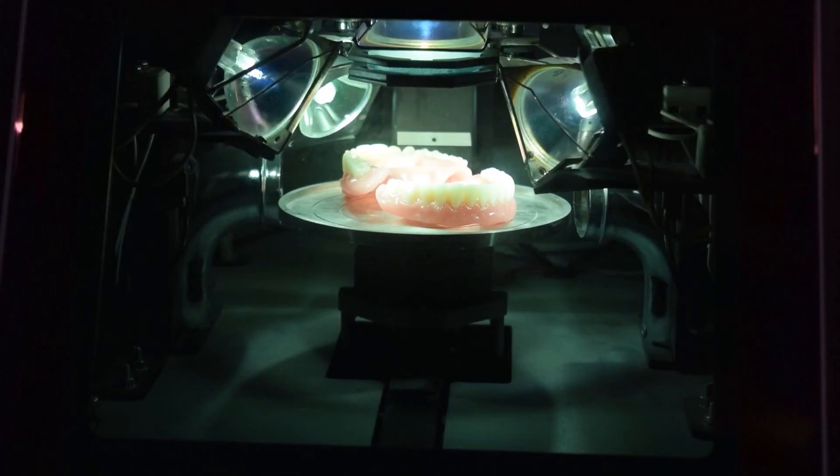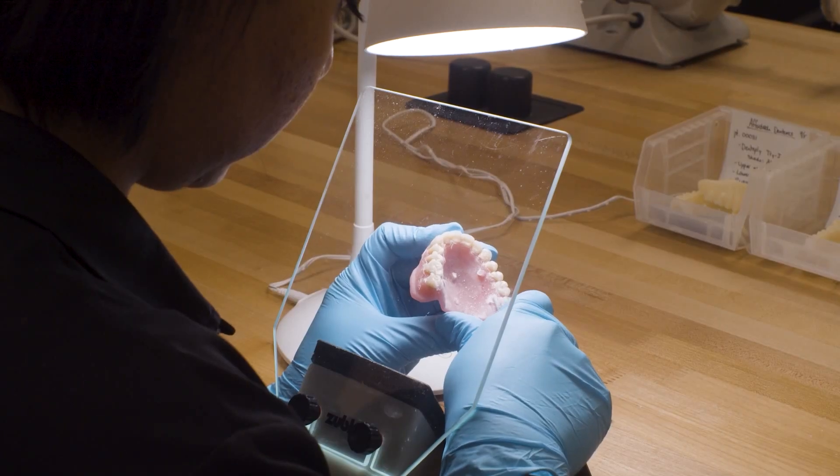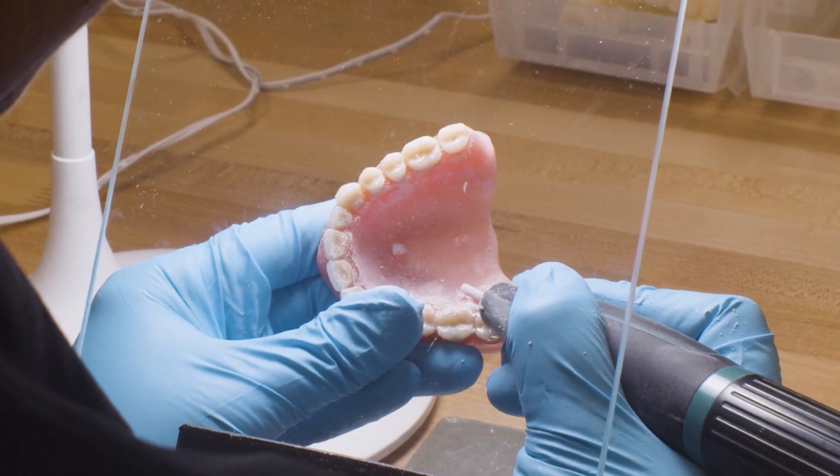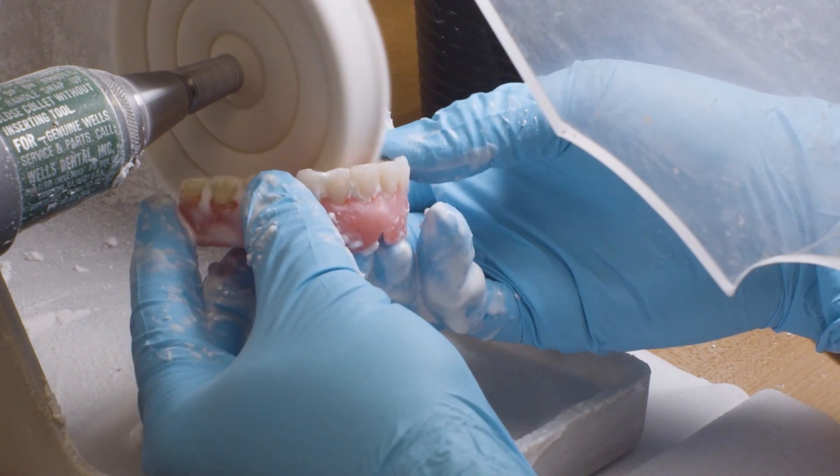Once the teeth are placed, the denture is placed in a UV oven for final curing. The UV light activates the photosensitive resin material causing it to shrink down, harden, and bind the denture teeth in place leading to a long-lasting secure single unit.